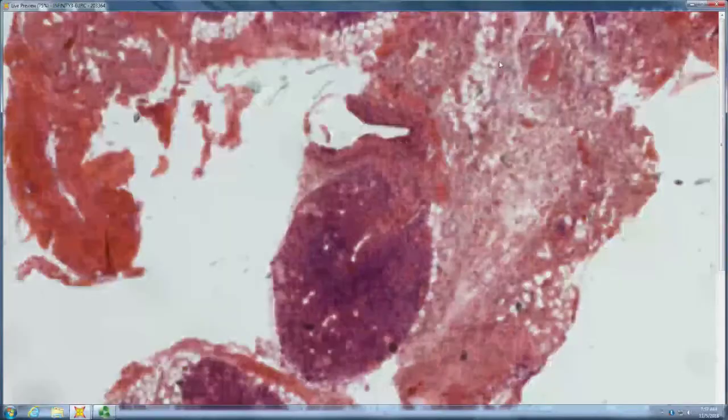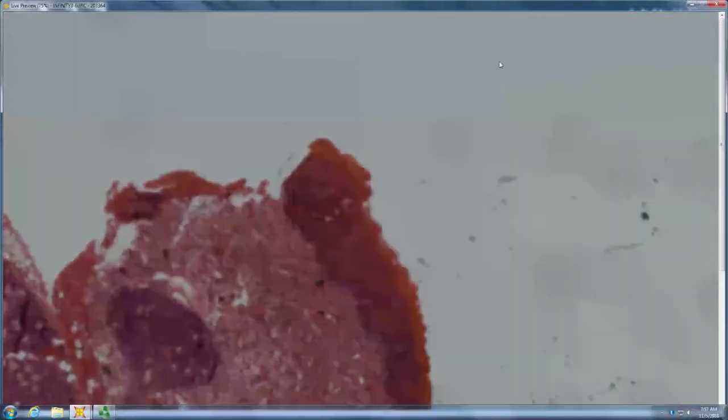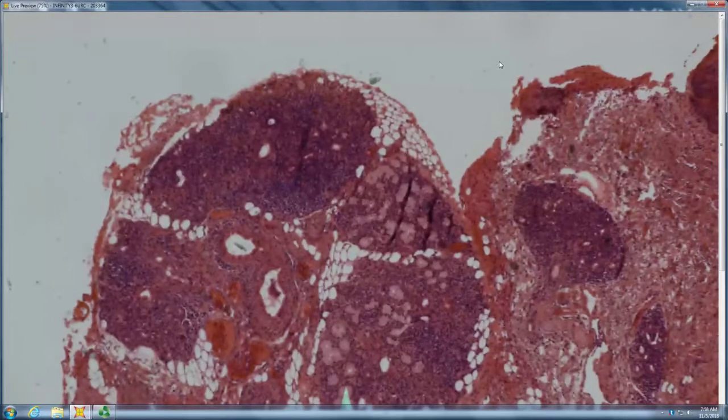Okay, so David, something totally different in the adnexal category. Where are we? Mucosal. And what are these things on the mucosa? These look like kind of ectopic sebaceous glands. They are not sebaceous, but minor salivary glands, right? Those are the normal minor salivary glands.